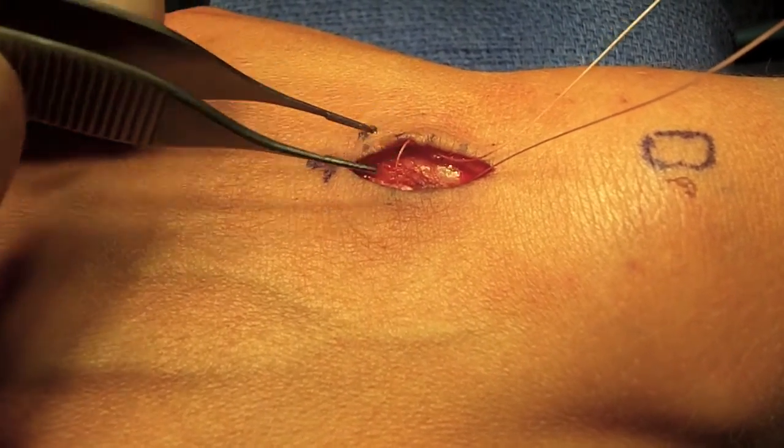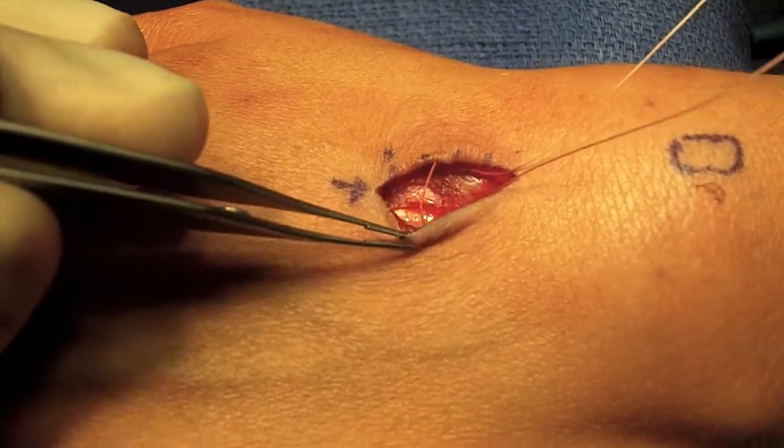The suture I'm using is a fast-absorbing, dissolvable suture material. The needle is very small, which helps me create a more perfect closure.